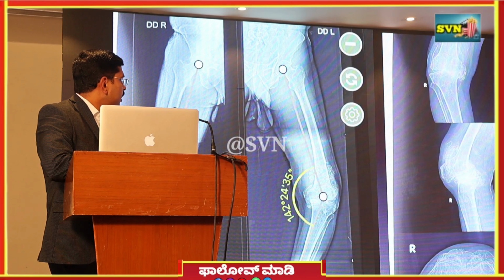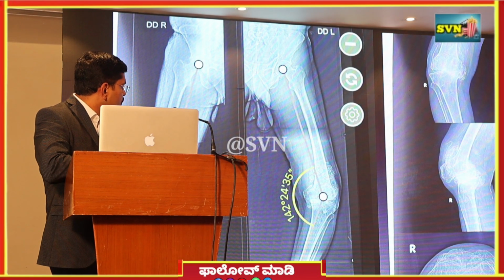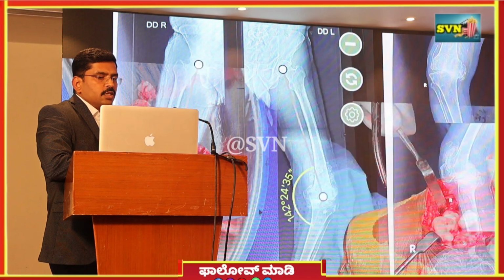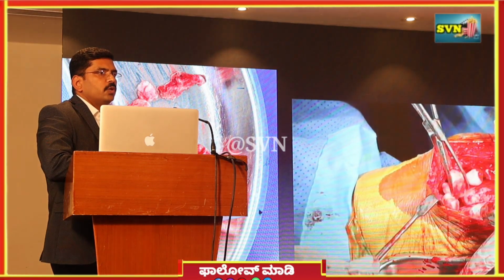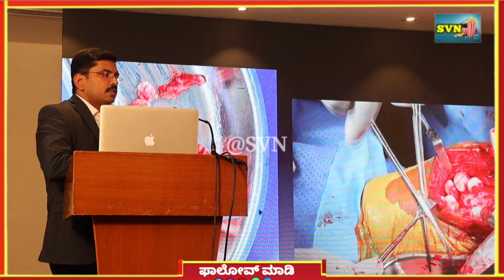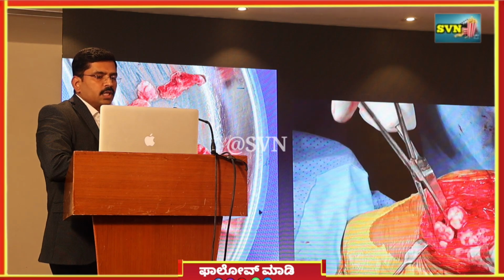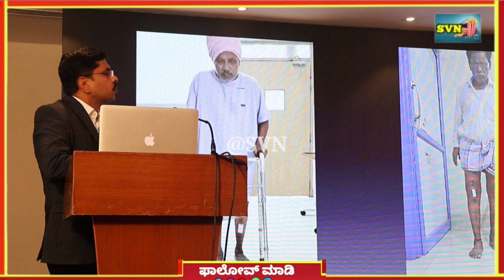So this is how his X-ray looks. And on table, with this X-ray you can see there are too many small bony particles. All these curves are osteophytes. So these were removed on table. Once all the particles are removed, the tissue becomes loose. But since the robo is there, we could comfortably balance his knee. And this is how he is walking 5 days post surgery. This is 2 weeks post surgery.